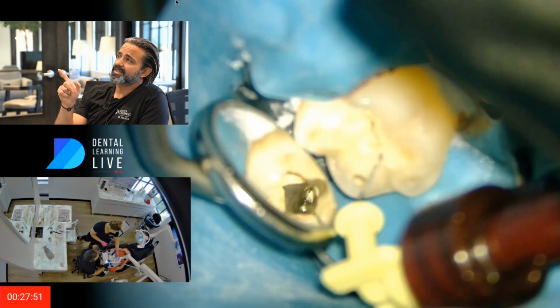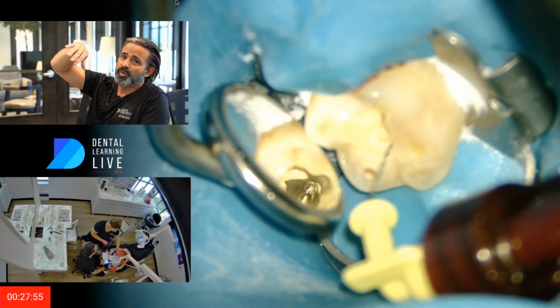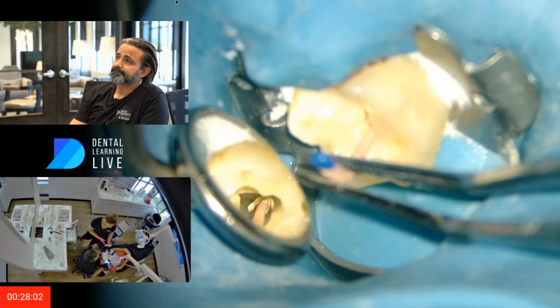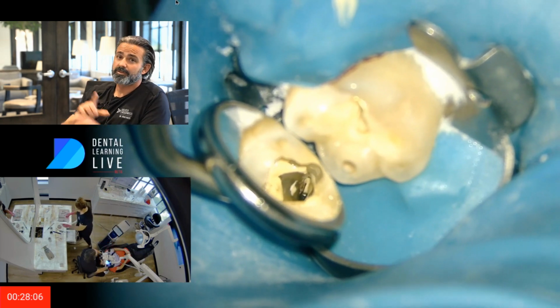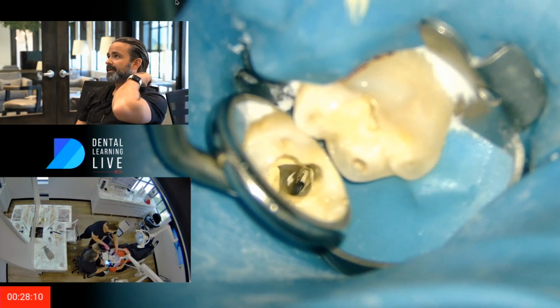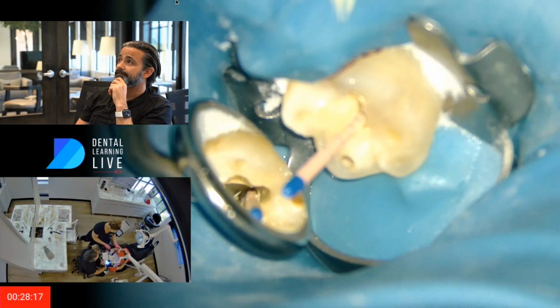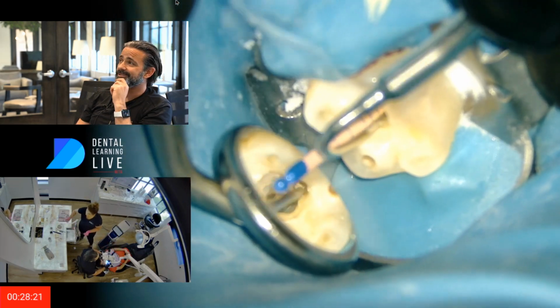So if you watch that sealer come in, you can see how it's just clean. That all those pulp stones, everything that was in that distal root's open. That ovoid shape. Two to one in that, and I crinkled the cone there. So time to get a new cone. It's kind of behaving on me now, holding still.